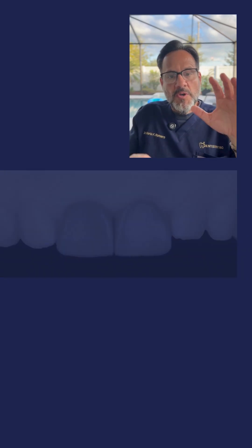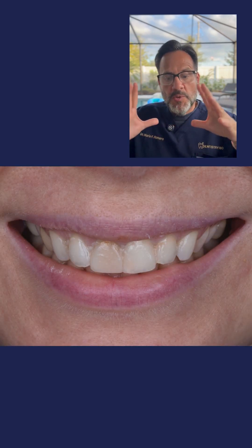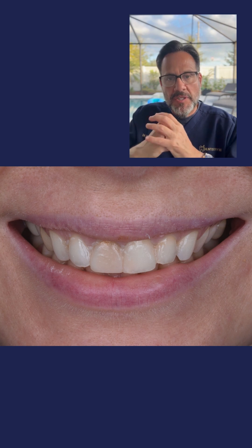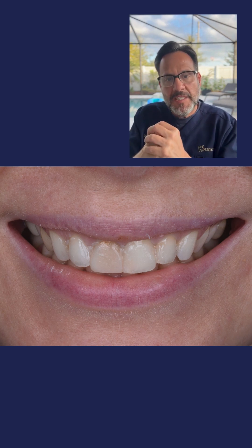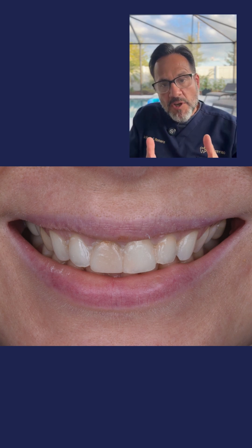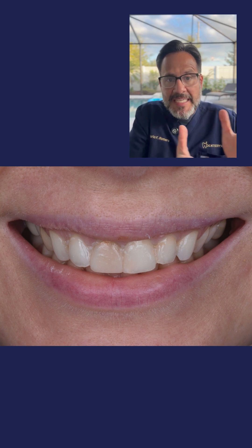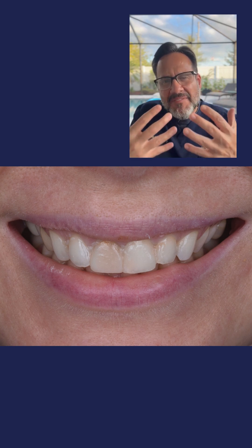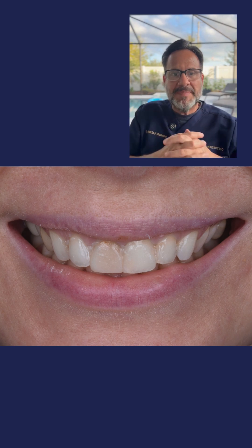Now let's go to photo number two. In photo number two, you are seeing the patient's smile. All I've done is obtained a PVS impression — or putty impression — of my wax-up, and delivered a mock-up directly inside her mouth. If you look at the photo, you can see that tooth number nine is darker, but you can also see that both teeth eight and nine have a little bit of additional volume that has been added.